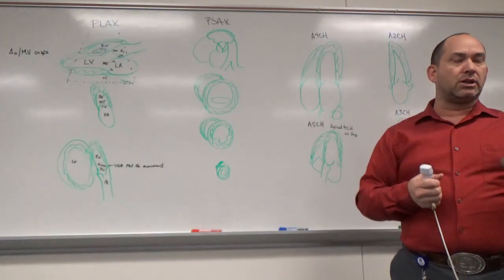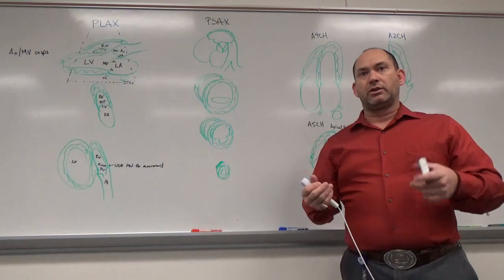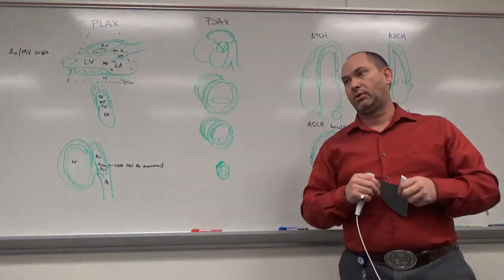So if you're struggling along and it's kind of dark and hazy, try something different. It's obviously not a good enough window. If your eye's telling you you're fighting what's going on, it's not a good window. Find something different. So how do we get a better window?